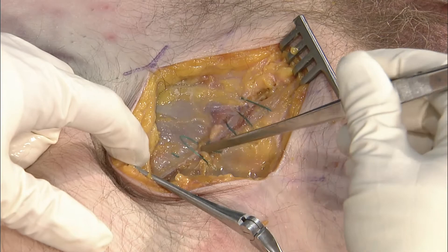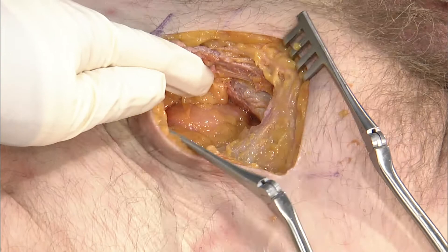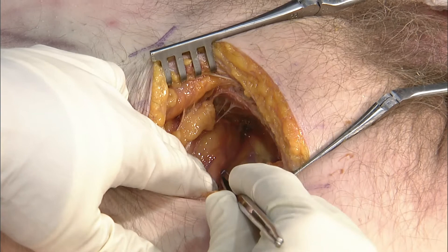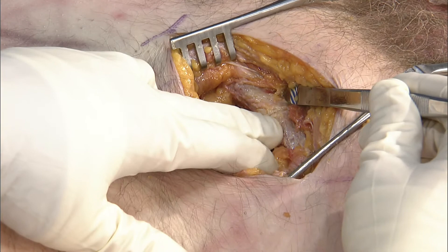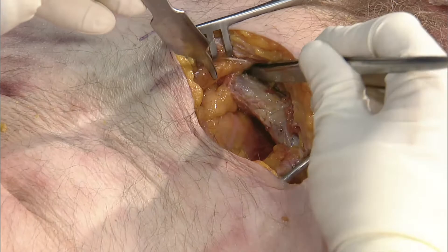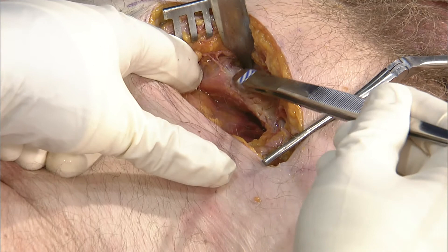Once you open that up — and here we're not finding any parts that don't belong, luckily — you can enter the space of Retzius. This is the space of Retzius, this is the bladder behind, and in front we've exposed our symphysis right in the midline. You don't have to peel down the entirety of the rectus, but you want to peel laterally and can bring a Hohmann retractor, Baby Bennett, or something similar along the side.